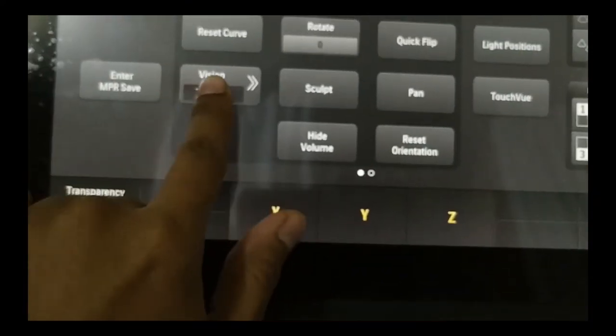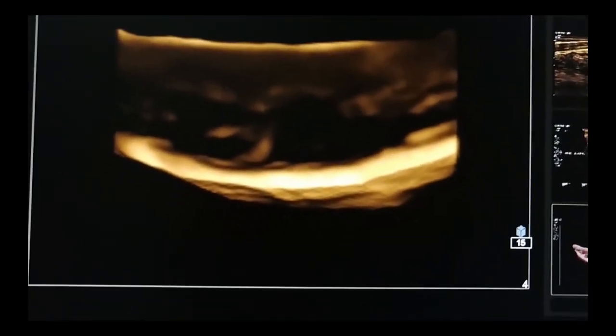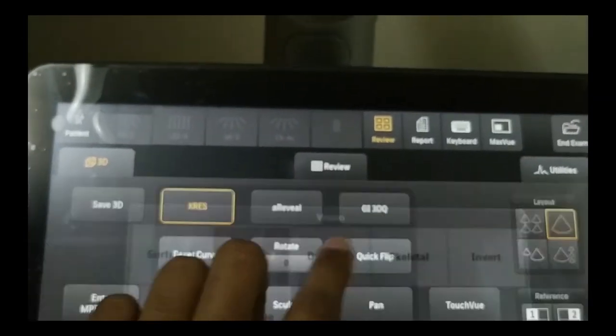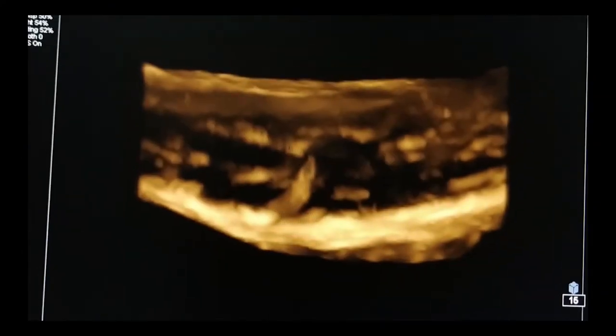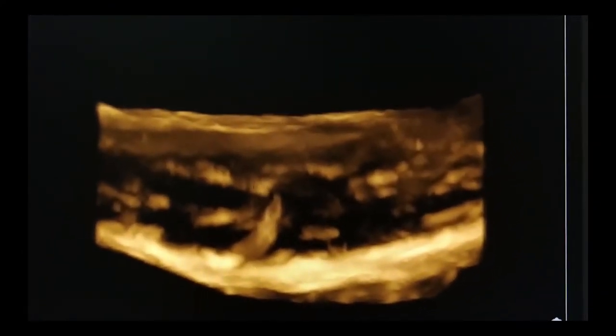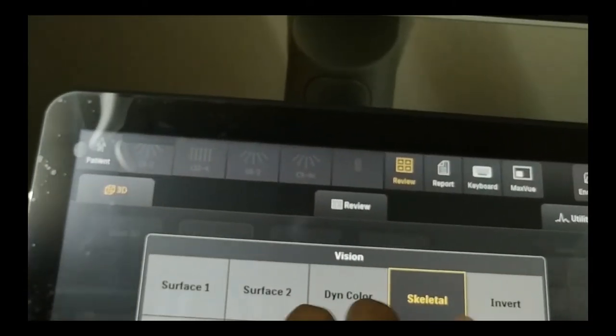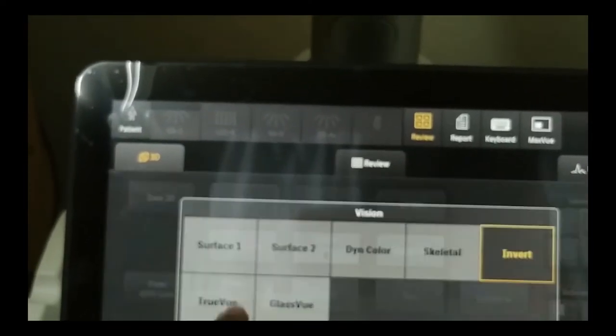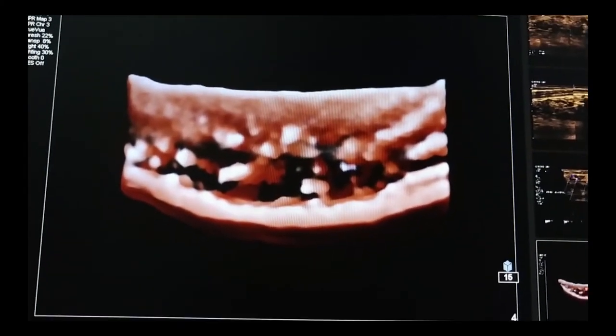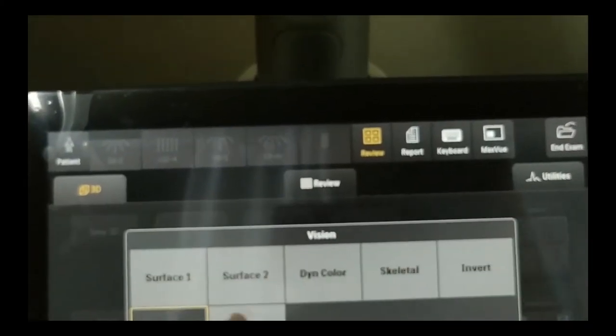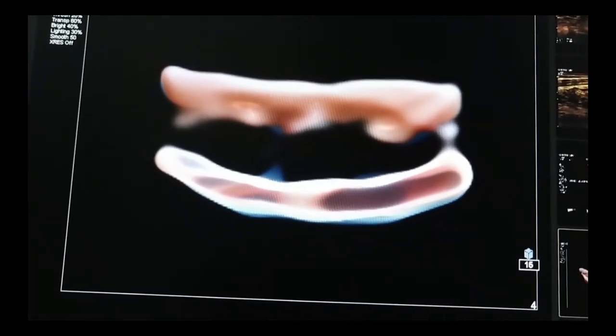Now I will change the view pattern — it's always fun, let's do it. Surface 1: not good. Surface 2: more darker. Dyn Color: it adds some colors on the darker image. Skeletal: that's not bad though. Invert: horrible. TrueVue: that's my one. Lastly, GlassVue: not so great in this case.